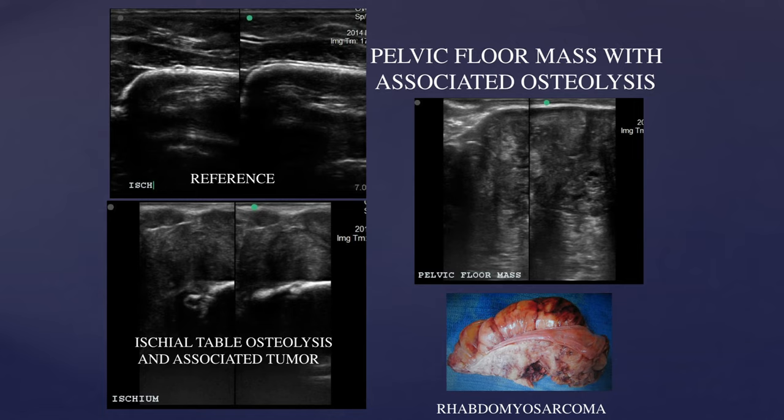Slide three shows a pelvic floor mass with associated osteolysis. You can see the normal reference images of the cranial aspect of the ischial table in the upper left-hand ultrasound, and then you can see the osteolysis of the normal bone surface along with an associated mass on the pelvic floor right at the cranial brim. The mass is demonstrated in a photograph at the bottom right-hand side of this slide, with an ultrasound of that mass above.